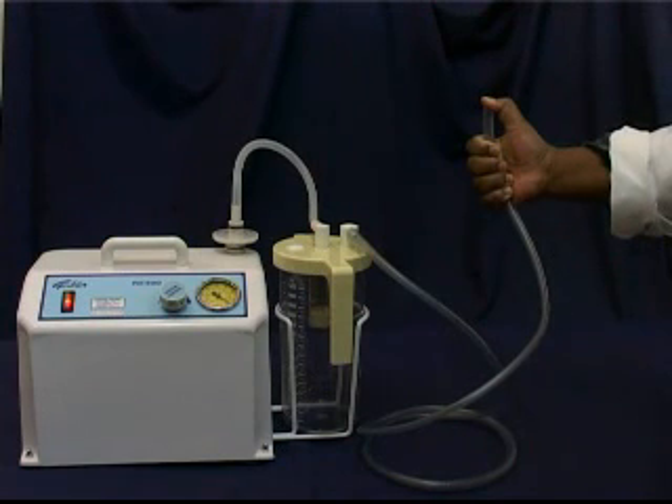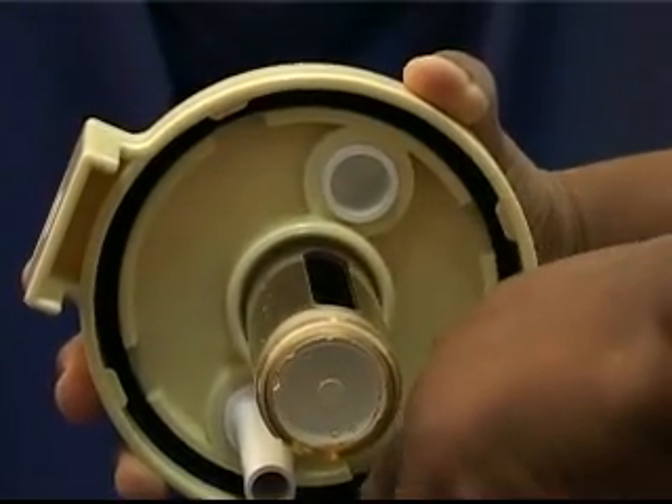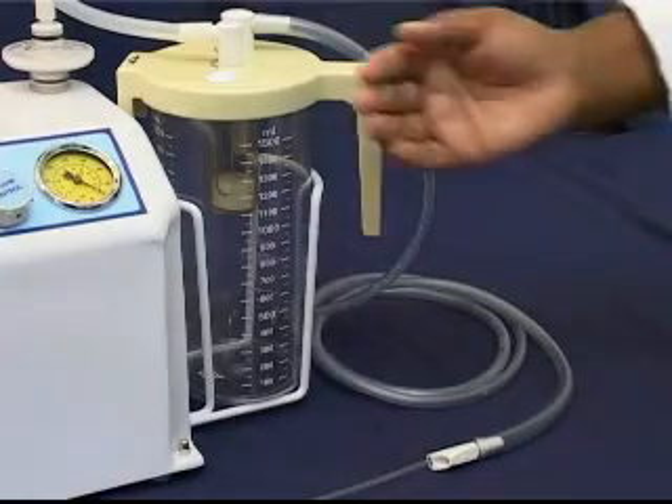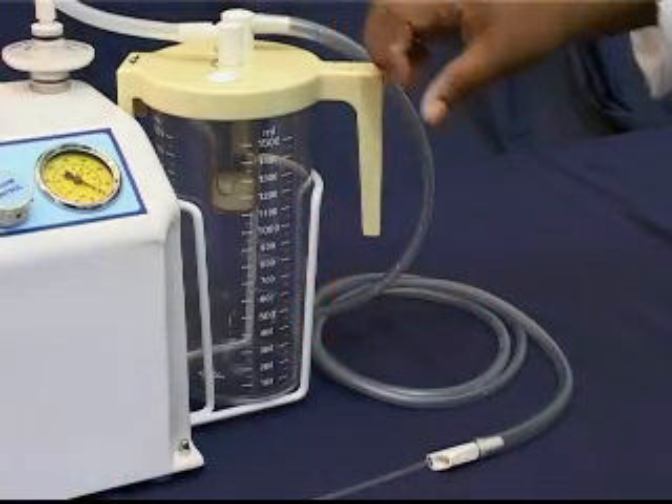Monthly preventative maintenance of the pump includes checking the vacuum and flow, as well as checking the condition of the gasket in the bottle cap. Checking the vacuum and flow is done with an empty collection jar.